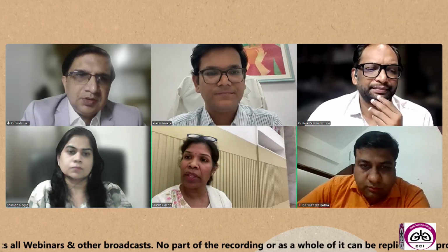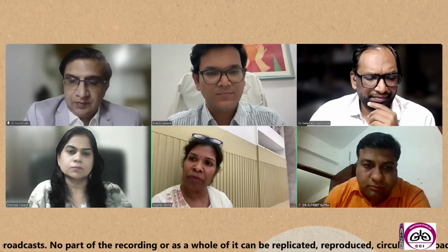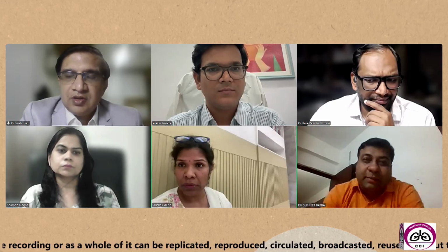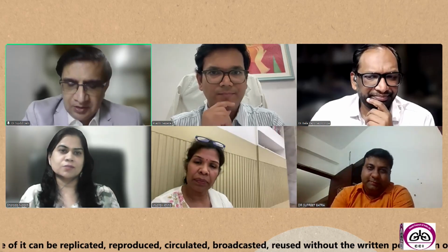It will also tell you whether you're short of material. You think you have taken a big sample, but it doesn't give you representative material, and it turns out to be a blood clot. But it's not mandatory. Sometimes we think it's a core, but it turns out to be a blood clot. Yeah, very common. It may happen that way.